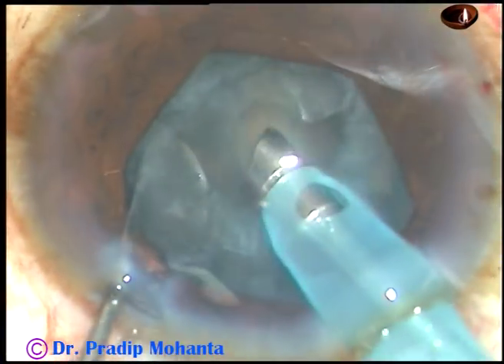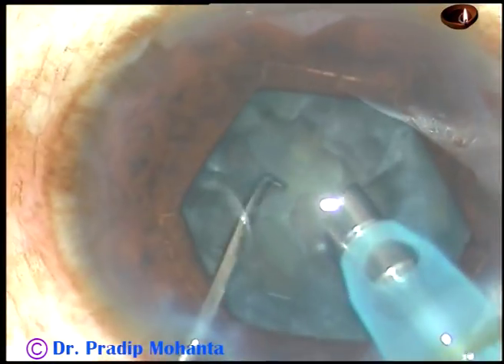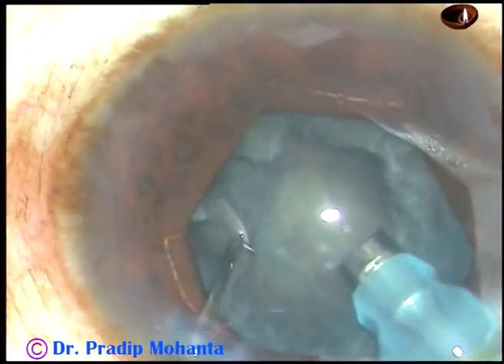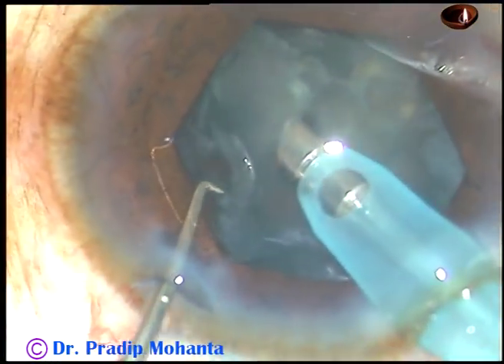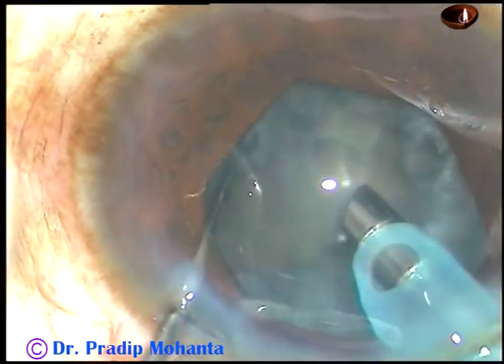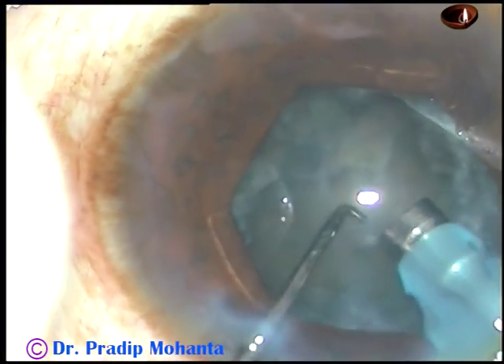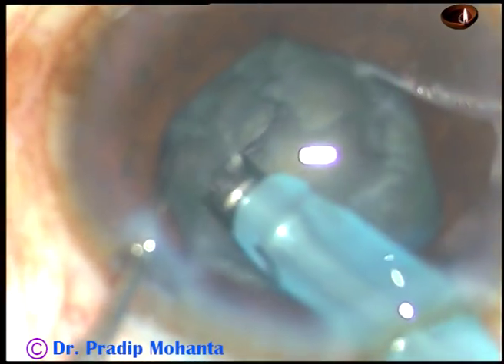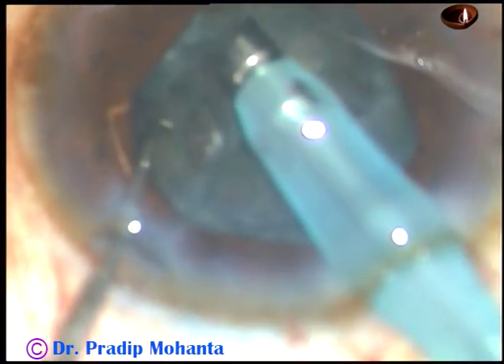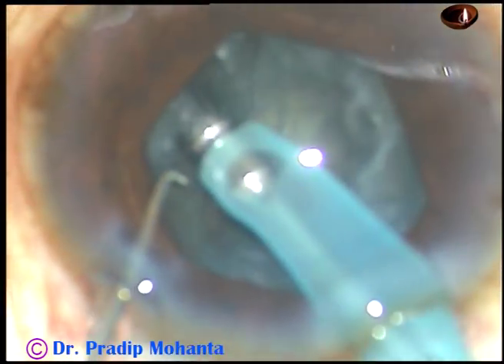As I try to make another chop, the nuclear mass came off — it became like a bowl. Wherever I am trying to catch the nucleus, it is just coming off, though the vacuum is 300, flow rate is 30, and phaco power is only 40 percent. Wherever I am trying to hold the nuclear mass, it is just coming off.